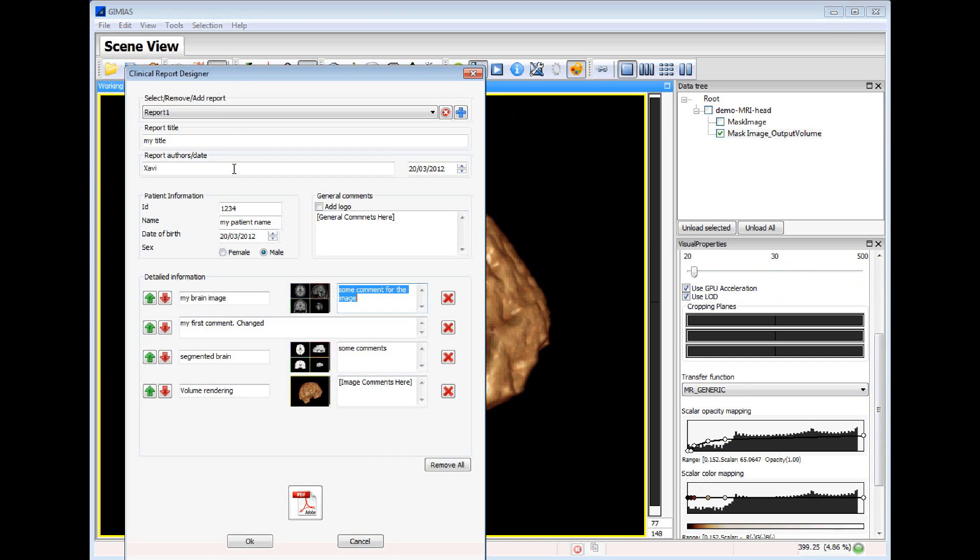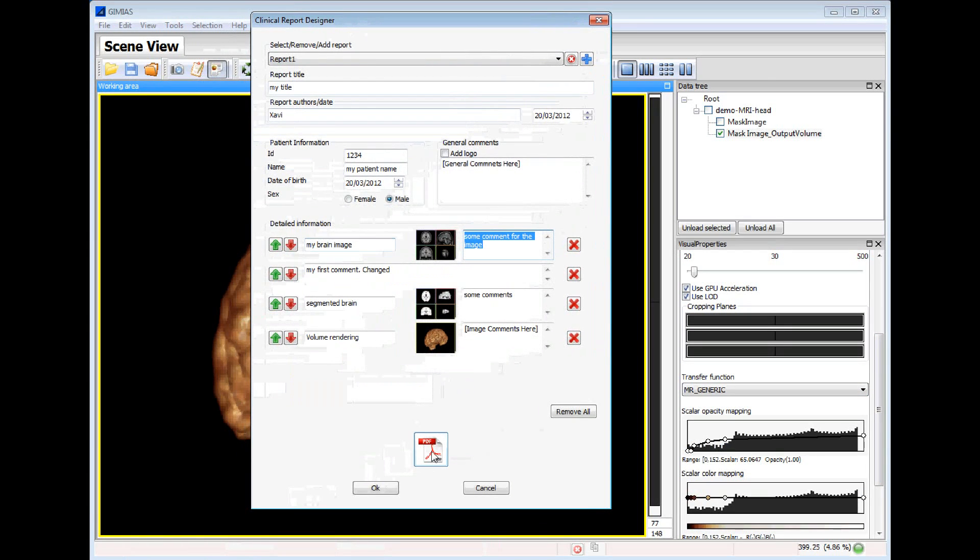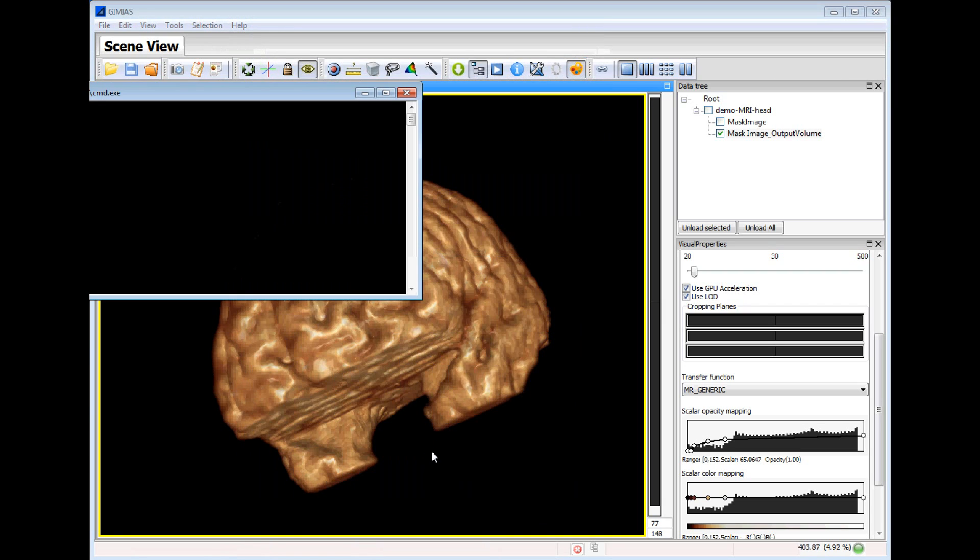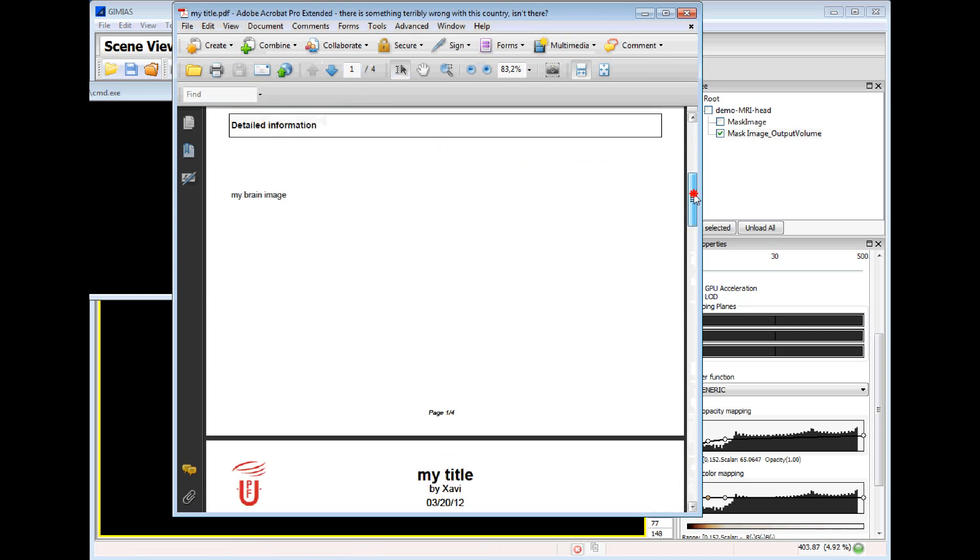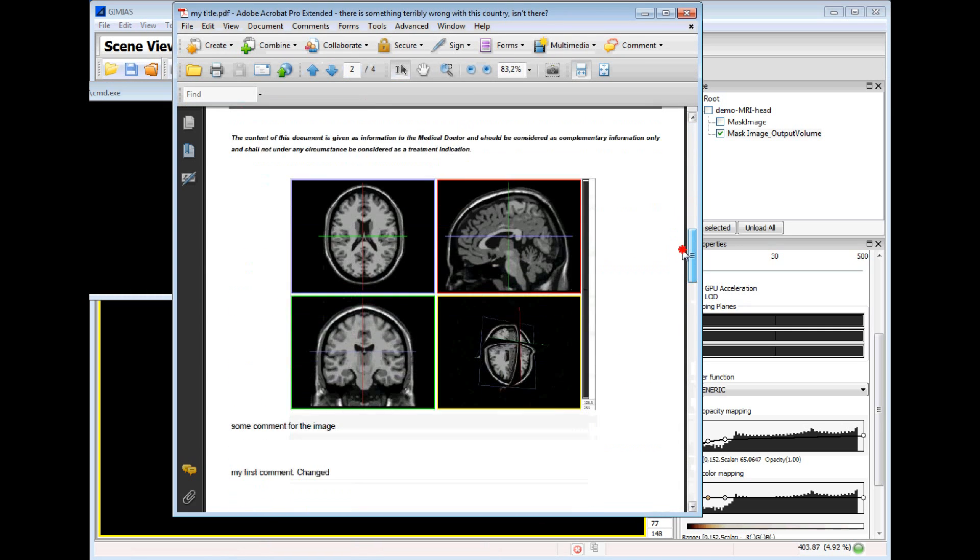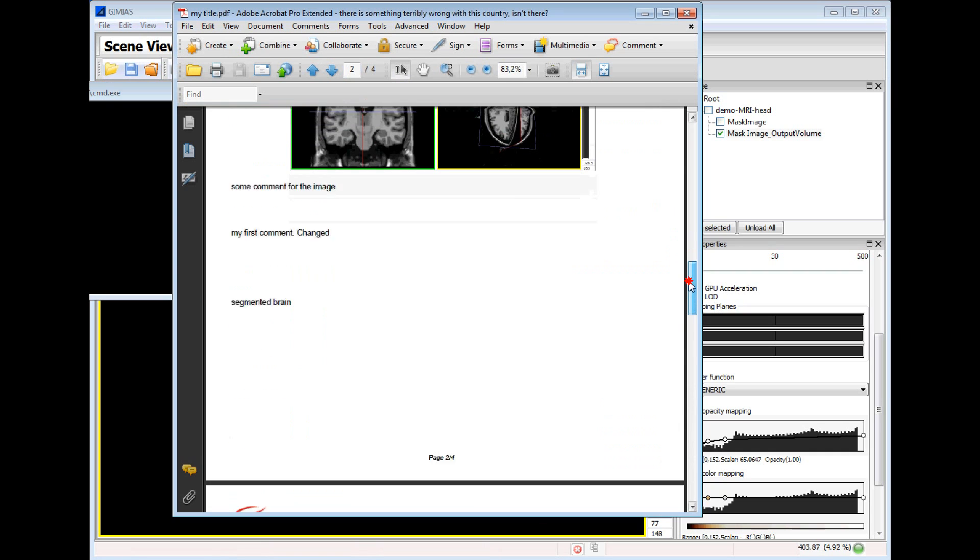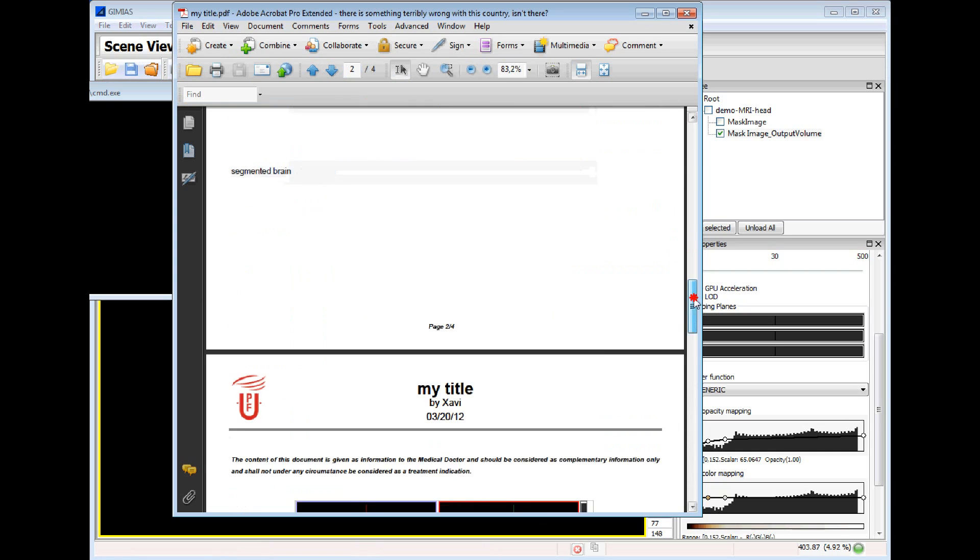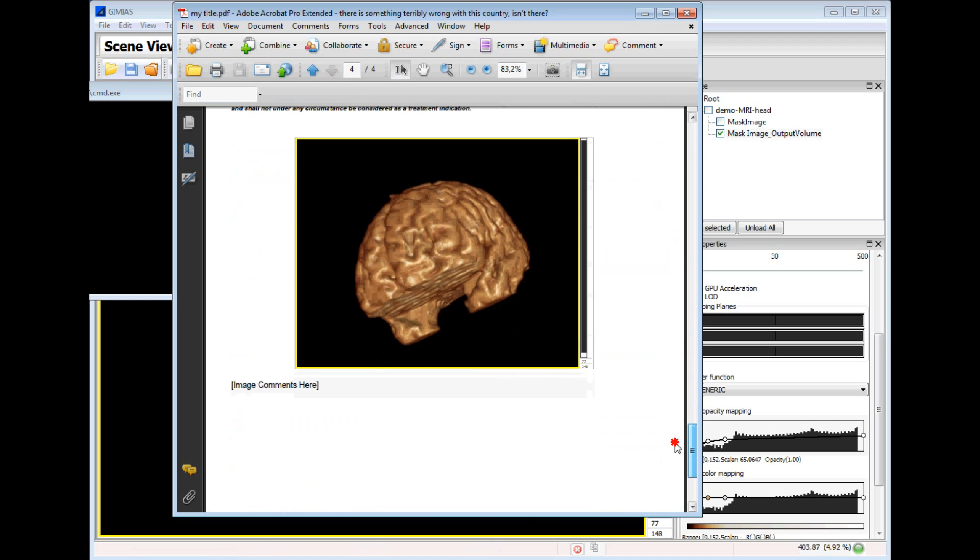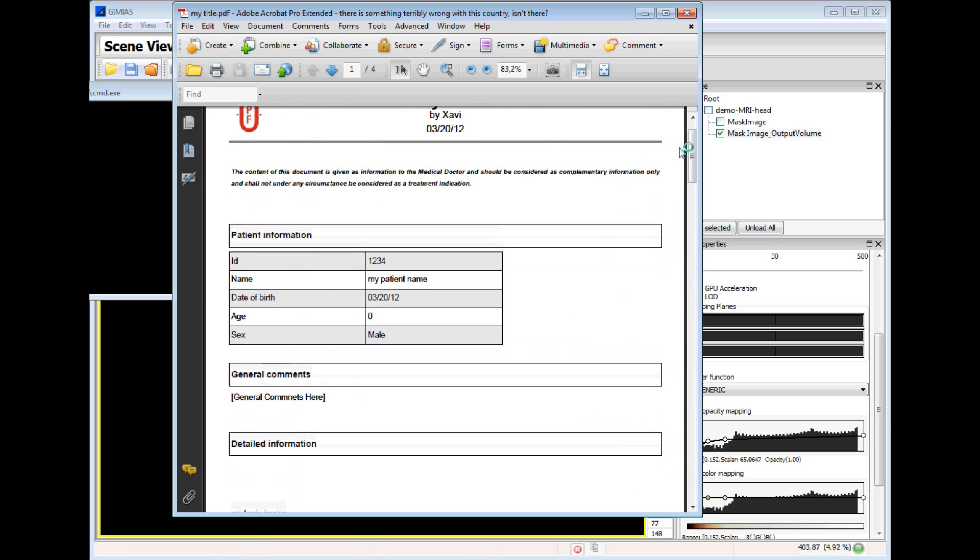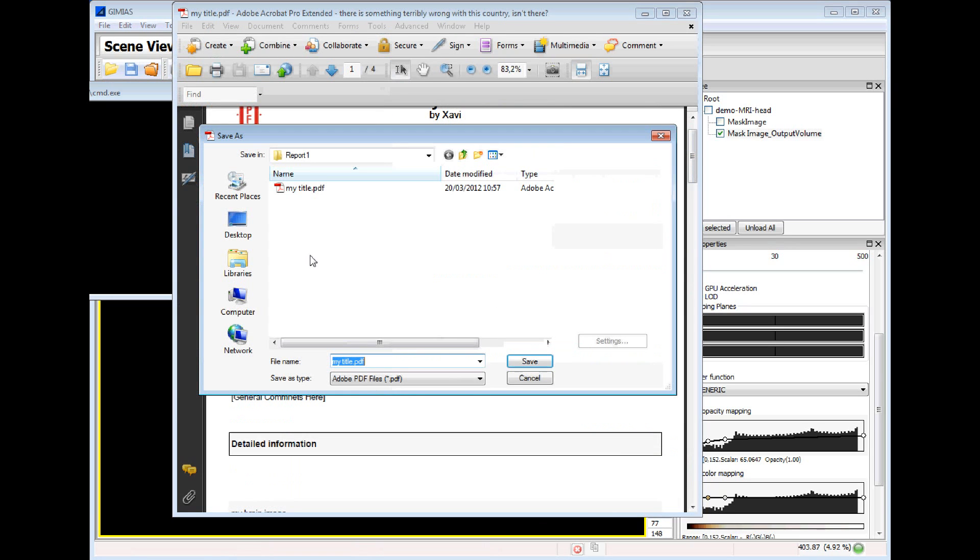We go to the clinical report designer. We can create a PDF automatically using this button. And this is the PDF generated automatically using the snapshots and the comments. And I can save this PDF in my folder.